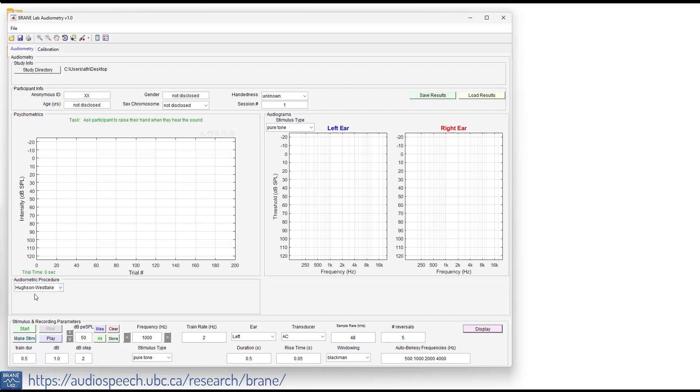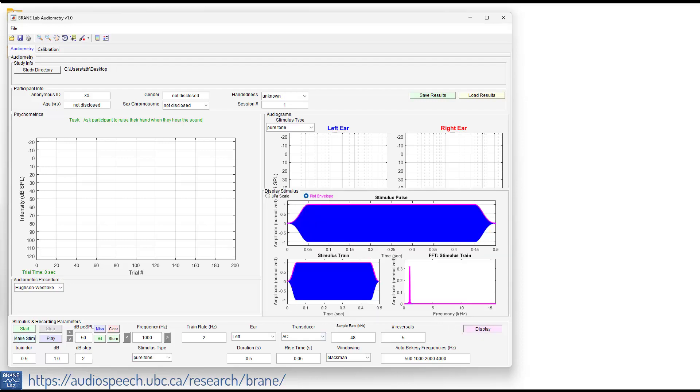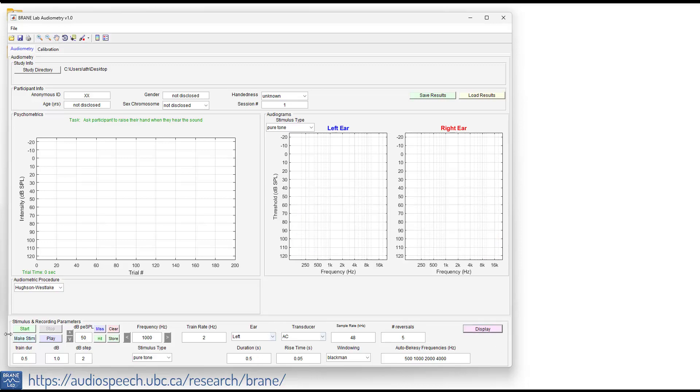So how we start this is we make the stimuli. That's going to be a thousand hertz. If you want to just display it, it's a thousand hertz tone here and it's going to be put on for 500 milliseconds. Then we click our start button. Now we're in testing session and we go ahead and hit play. And participant raised their hand. I heard that. So we hit click and then we go down.